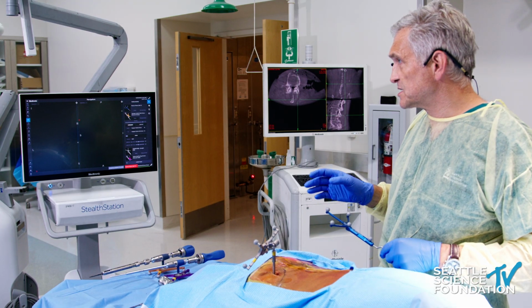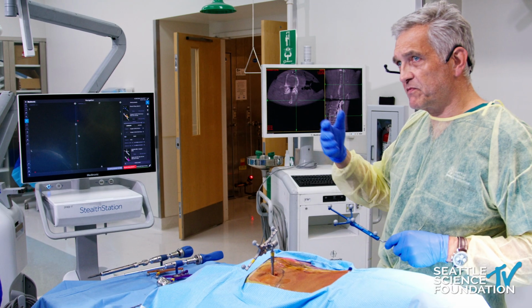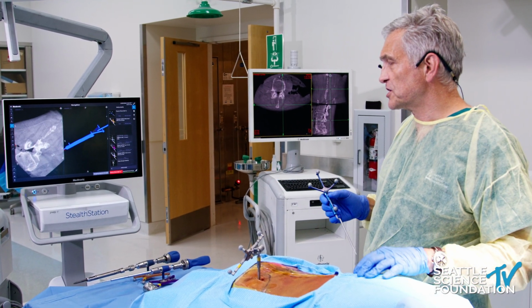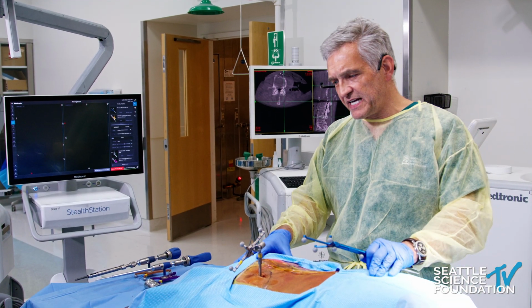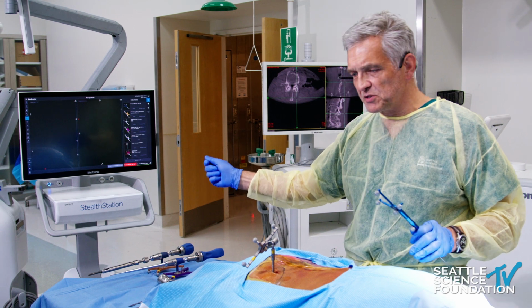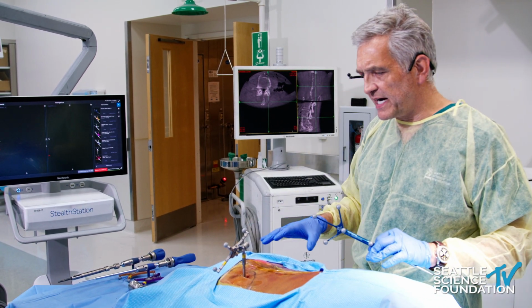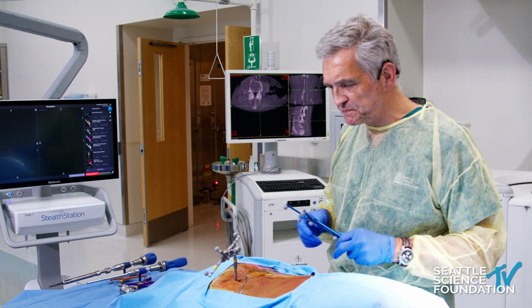What I make sure, especially if you do an operation where you're going to use navigation throughout the procedure and you're starting off with pedicle screws, you want to make sure that you really stabilize the patient. And I use a lot of tape to really tape down the skin. I pull the skin down sometimes towards the bottom of the table to get everything nice and tight, so nothing is moving, especially in patients who are a little bit more obese.